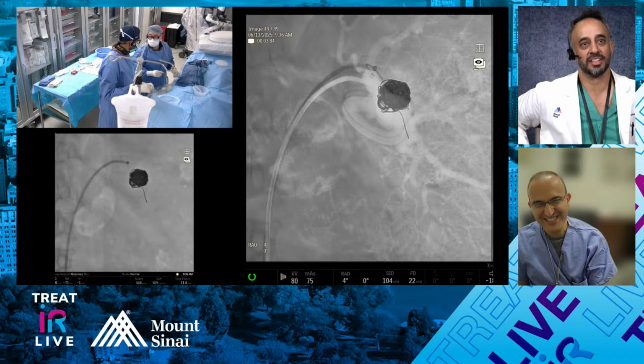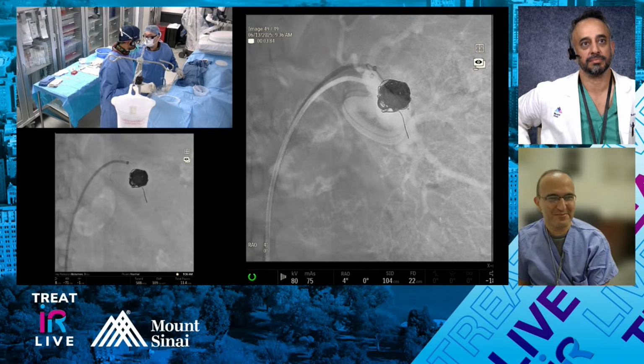Here's food for thought. Can we get forward on the side flush, please? Just for like 2 seconds, and then we can stop.